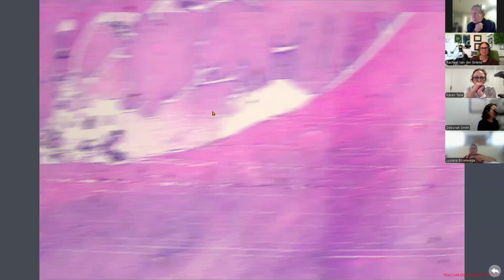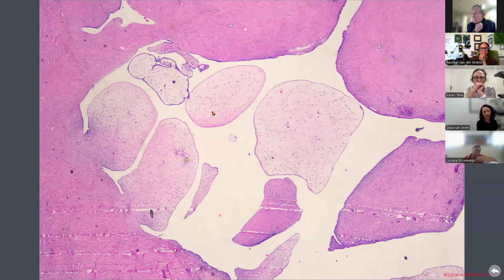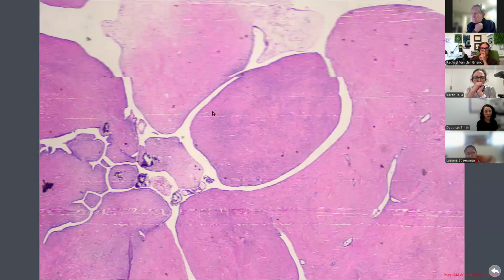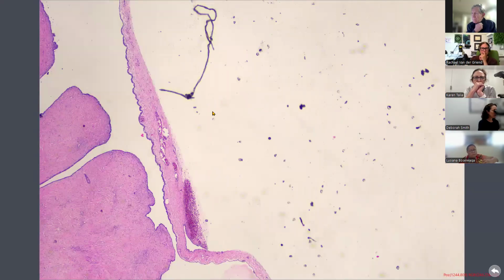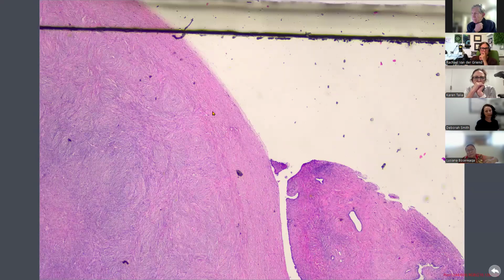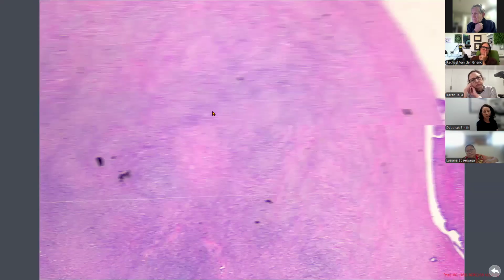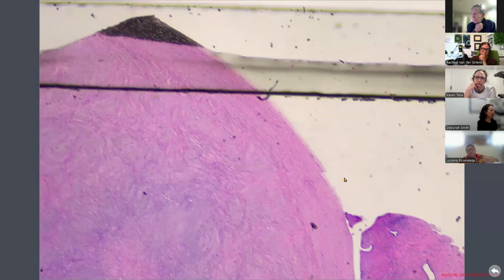I thought I'd bring this along for interest because when we came back up, if you just look at this at first glance, it's quite difficult on the slide to know where you are. But if you come back out, you get a sense that this is your cortex. So you've got your normal ovarian tissue down through here, and you come up and get the sense that this is that collagenous tissue just below the surface. We've lost most of the epithelium across there.